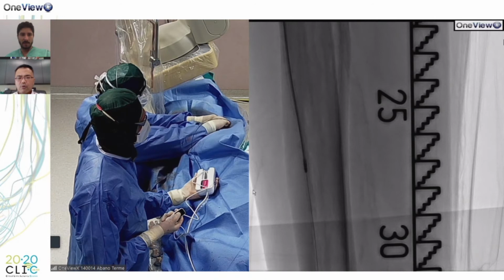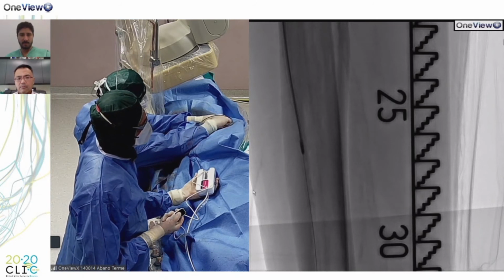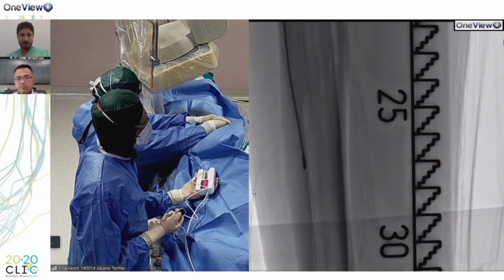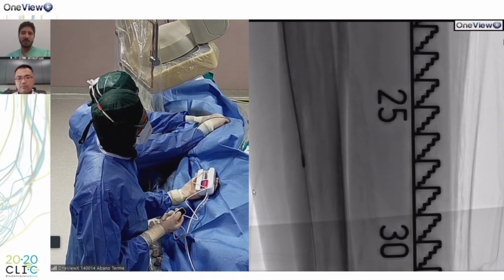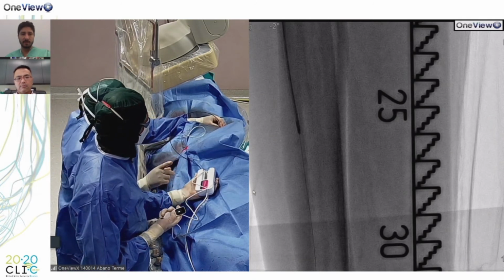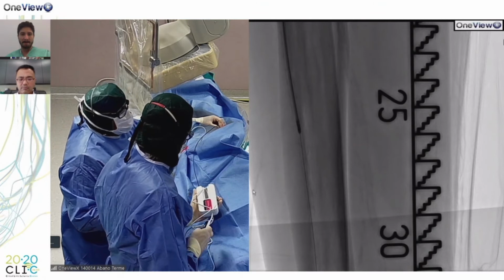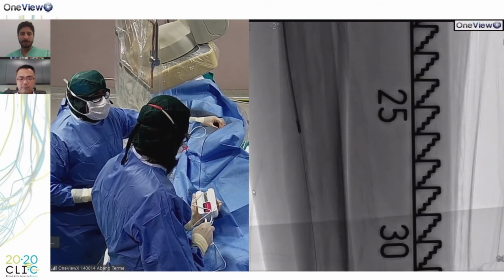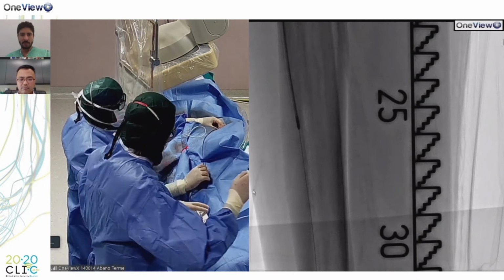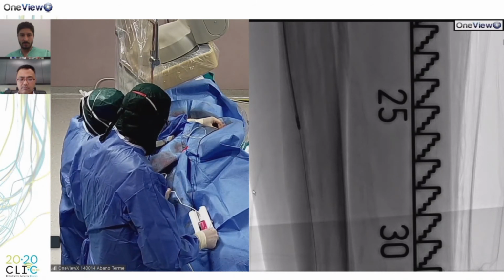Marco, in most of your practice, do you require any pre-dilatation, or does the catheter engage quite easily most of the time? Yes, could be a suggestion. But did you do some pre-dilatation right now, or did the catheter engage the artery up to this point by itself? Okay, now we remove the probe and we go with a pre-dilatation balloon. Please give me a 1.5 or a 2 Jade balloon, please. Yes. Go.